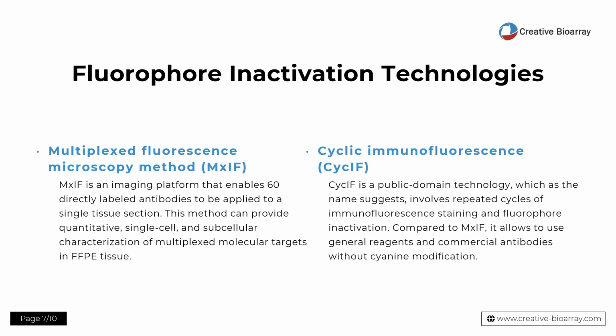Fluorophore inactivation technologies. The principle of this technology is roughly similar to stain removal technologies. However, it does not rely on using different pH conditions, denaturation, or photobleaching to remove a stain, but on chemical inactivation to eliminate the fluorophore.